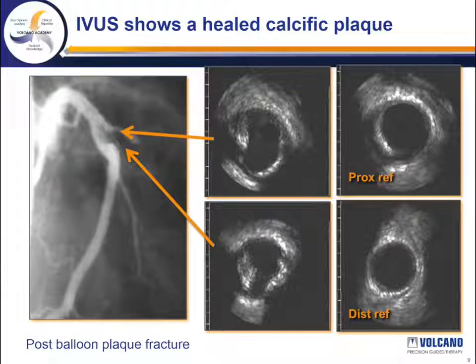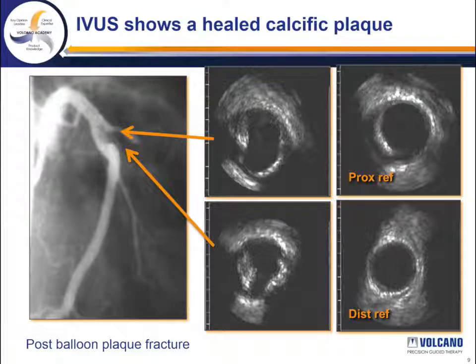Let me outline the area in these two sections — you can appreciate the kidney bean-shaped appearance in the more proximal section and the clear dissected calcified plaque in the inferior picture.